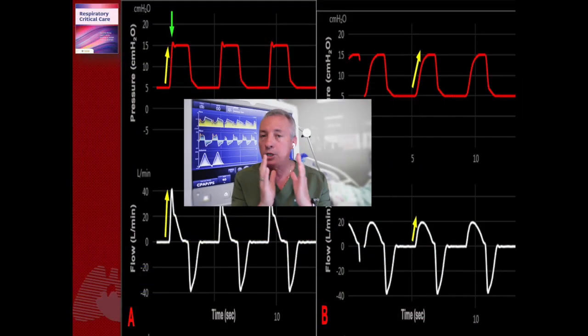So how fast it is will really depend on patient needs for the speed that you need to achieve to deliver that pressure. Remember, something that you don't want to see is an overshoot of the pressure. So if the pressure is going way too fast, you need to slow it down or change the ramp until those dog's ears at the beginning of the breath on top of the pressure just go away.